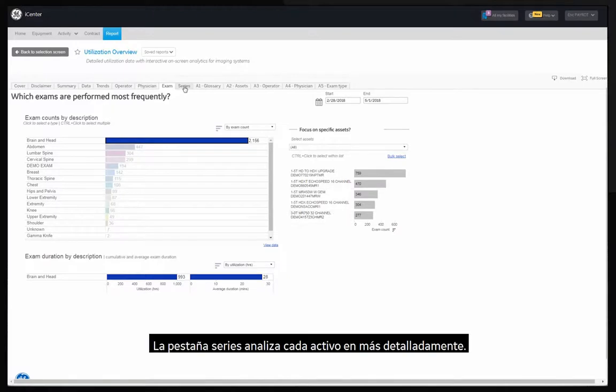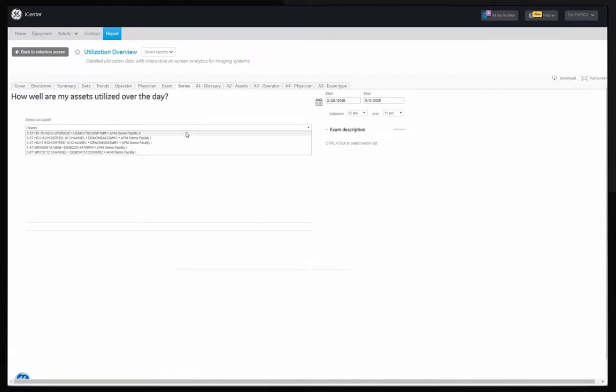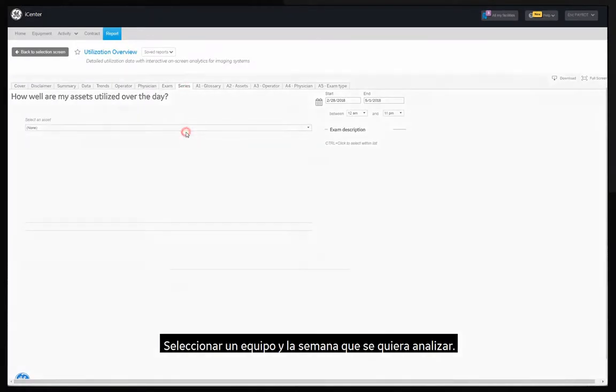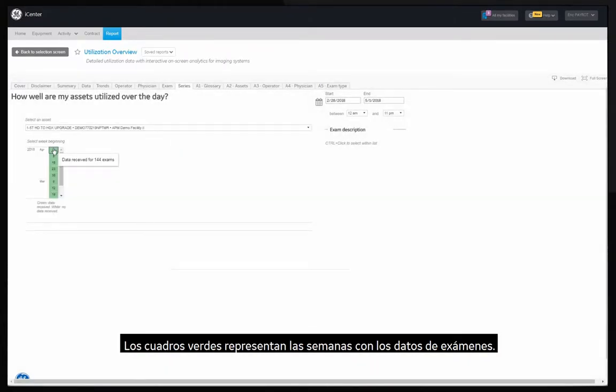The series tab looks at each asset in greater detail. Select an equipment and the week you want to analyze. The green squares represent weeks with exam data.